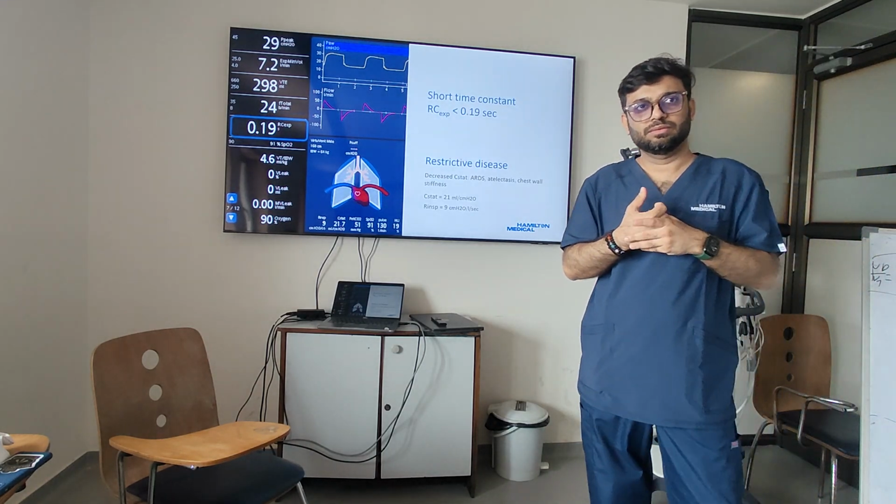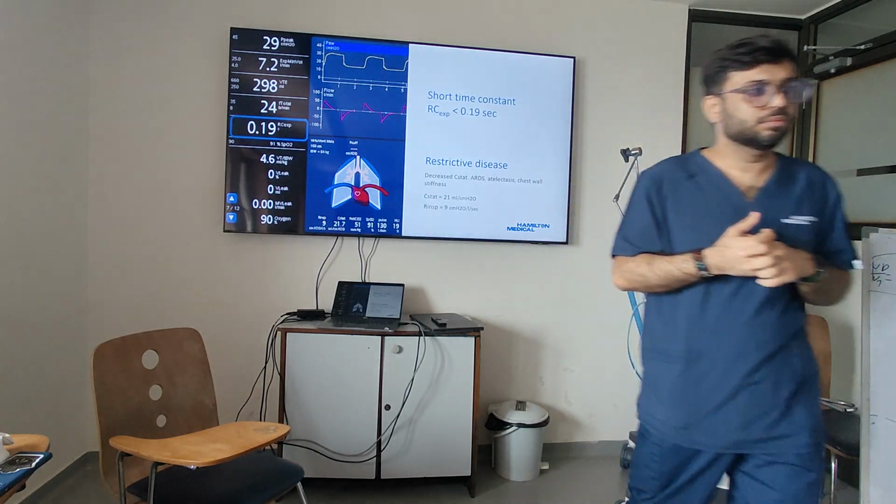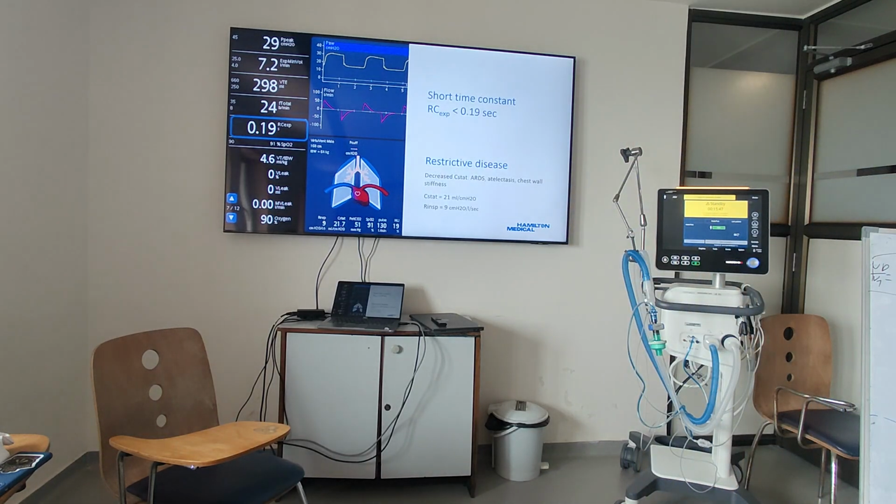No, he was bed number 8, he was spontaneous breathing. So that is an IntelliVent.